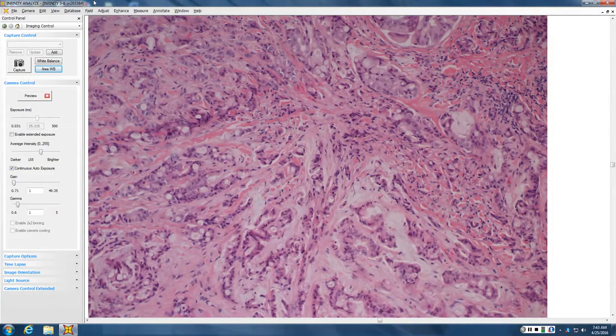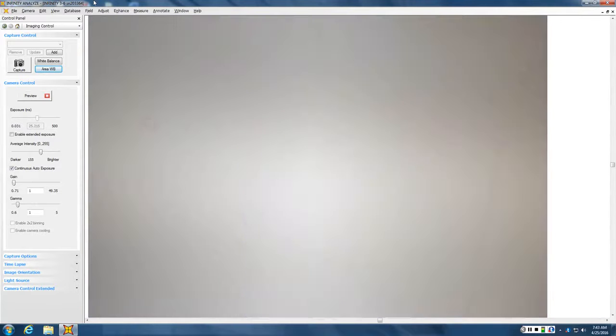The recognizable patterns that drive you in one direction or another are the ready knowledge that you should have for these. So that's what we're going to focus on, some of those specific patterns.